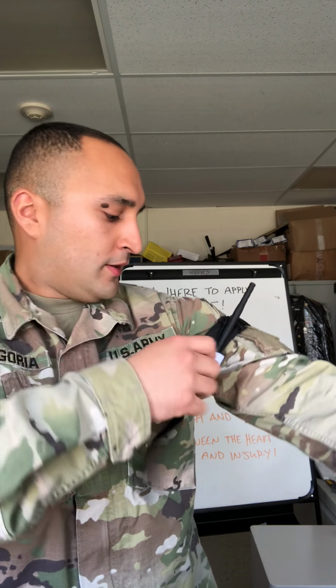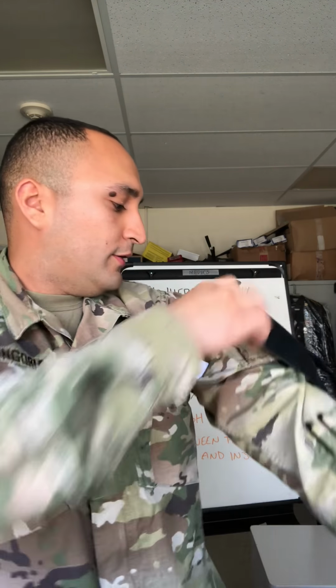Keep in mind, if you move your patient, to reassess your combat application tourniquet and use whatever means you have, whether it be tape or wrap, anything you can to put around it to help secure the combat application tourniquet. Now, the purpose today was to introduce you to the combat application tourniquet. I wanted you to understand how it can save lives and how easy of a tool it can be to use in order to save a life, and also when to use a CAT tourniquet and how to use a CAT tourniquet.